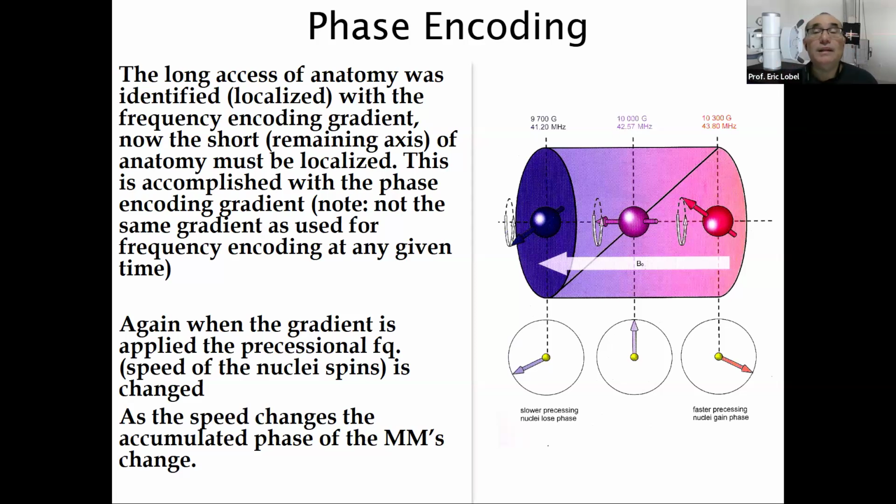When we place information in the middle of K-space, we're going to get more signal. When we place the echo towards the periphery of K-space at either end, we get more spatial resolution. But today's lecture is really about how do we just get it in one of these lines, right?